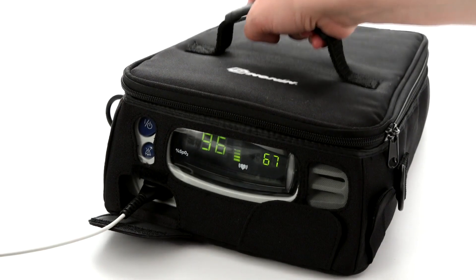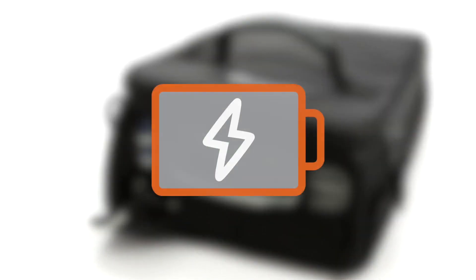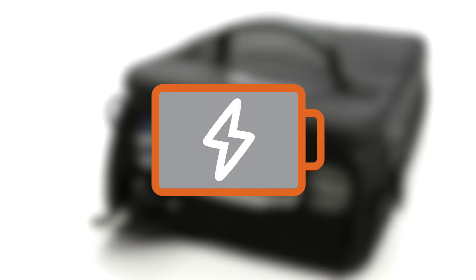Recharging takes about 4 hours when the battery pack has been depleted. The 16-hour battery life allows the Nonin 7500 to be used as a portable oximeter when needed, for example in transit. Additionally, the long battery life provides peace of mind in times of power outages. The low battery indicator will blink when the battery is getting low and stay on continuously when critically low. Recharge the battery as soon as possible.